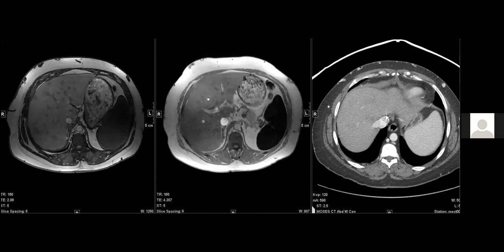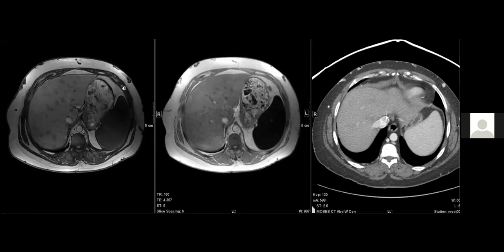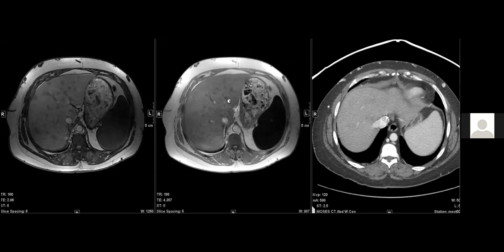That's really cool, because you can tell they're fatty nodules because you put her on 1.5T, and you were able to do that immediately. Correct. That's awesome. Yeah, I forget how it happened that I caught this case. It's a fairly old case, but it did happen. Impressive.